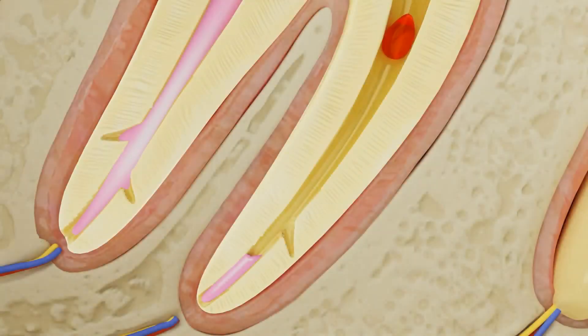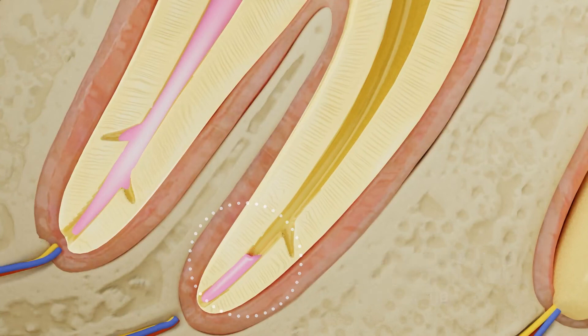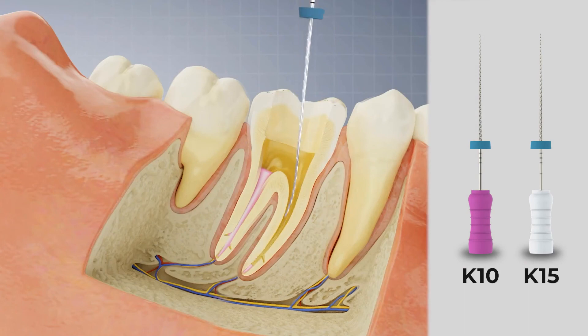If you are encountering significant resistance, use a drop of solvent to soften the gutta percha in the apical portion. Finally, use a K10 or K15 manual file to establish patency.